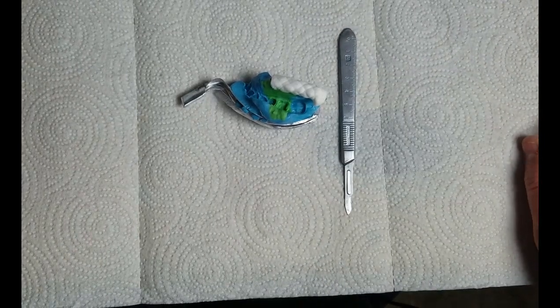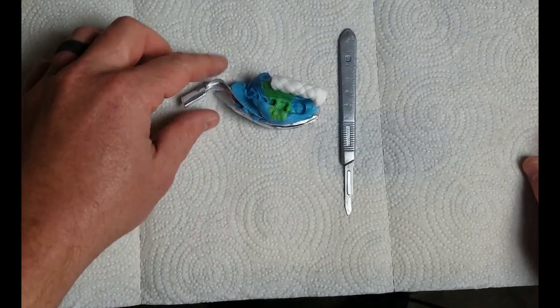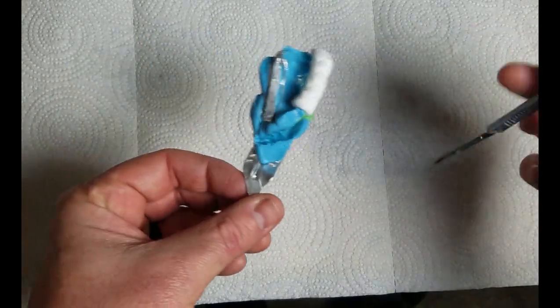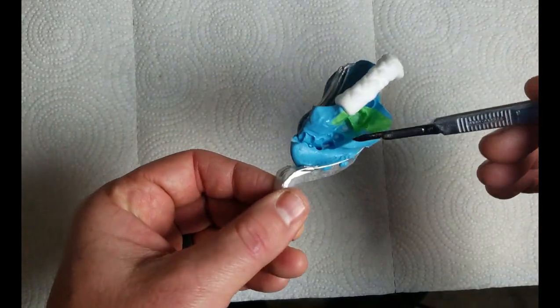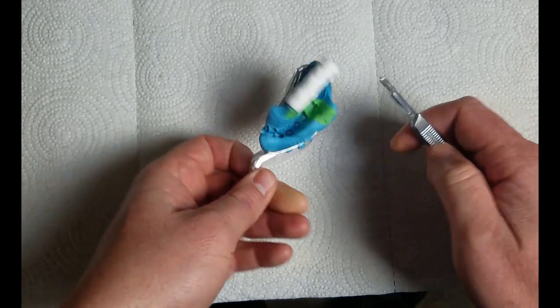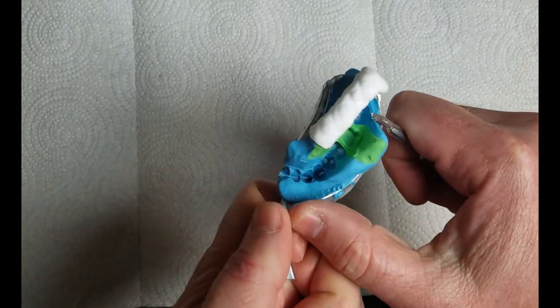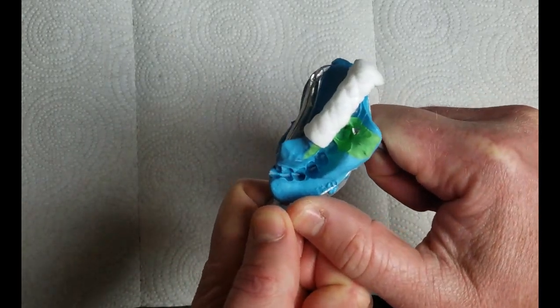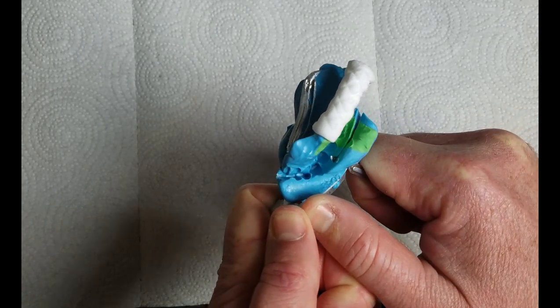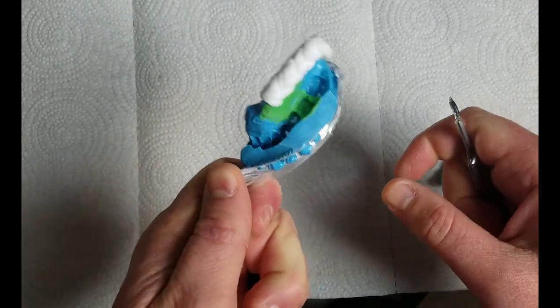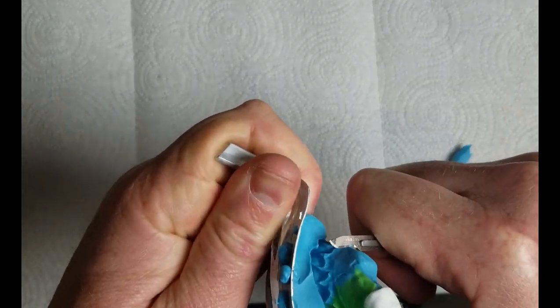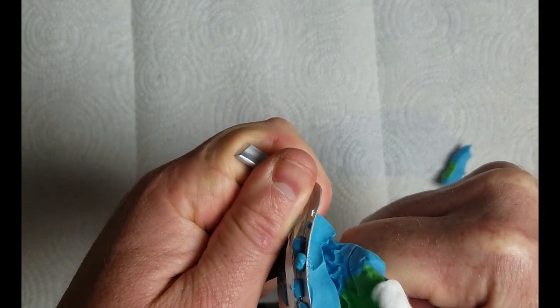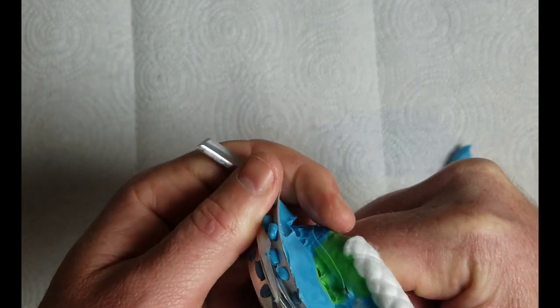Whenever preparing to scan a triple tray impression, it's always useful to eliminate any deep vestibular areas. These tall areas can cause problems with the camera getting in there to see the impression clearly. So what you can do is simply take a scalpel or any type of sharp blade and just reduce the length of those vestibular areas.